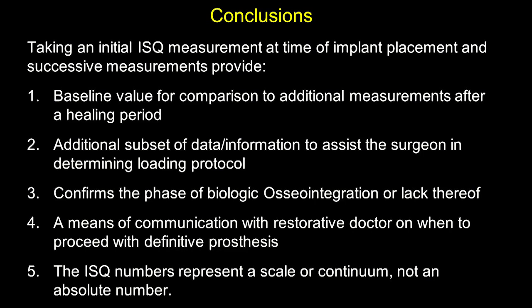And I would like to remind all of you remaining in the audience that the ISQ number represents a scale or a continuum, and it's not an absolute number that we need to try to identify.